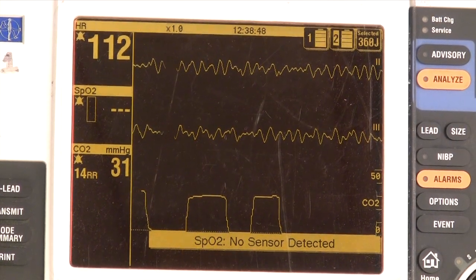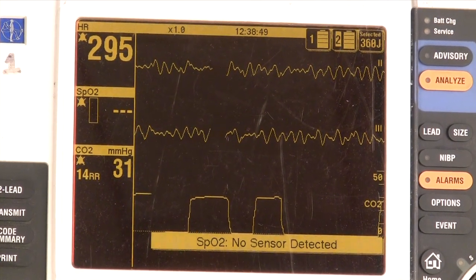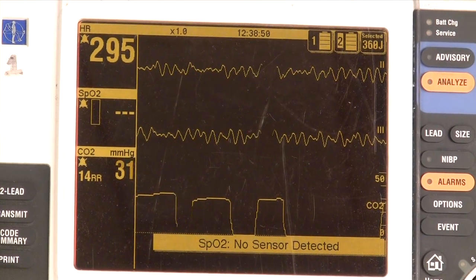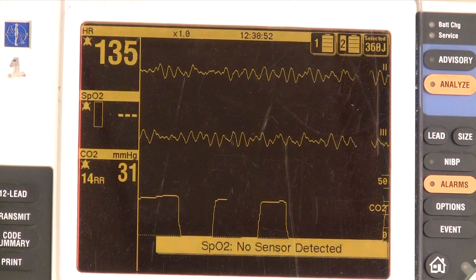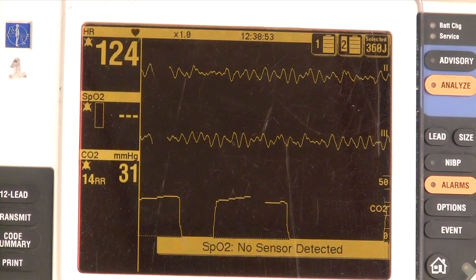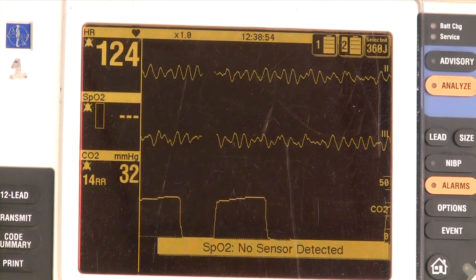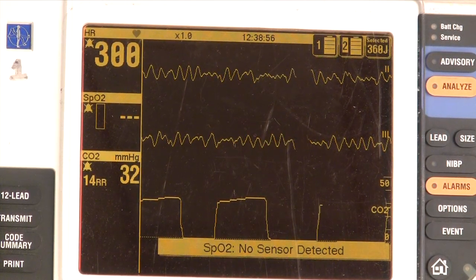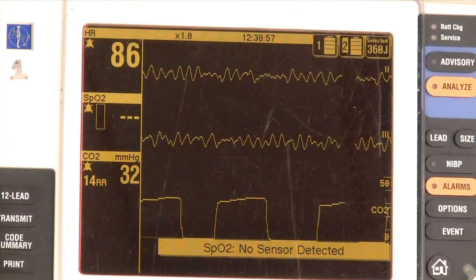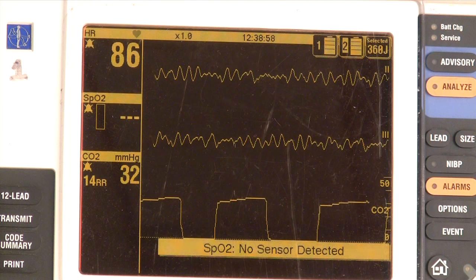Waveform capnography is an important new tool in the treatment of both cardiac arrest and the perfusing patient. To put it simply, capnography measures the byproduct of metabolism, CO2.